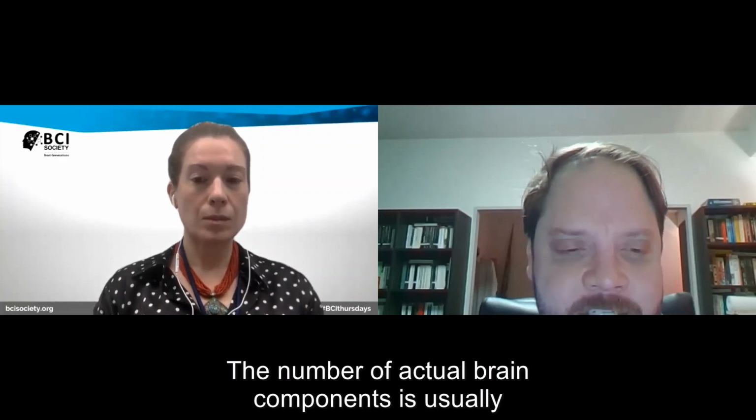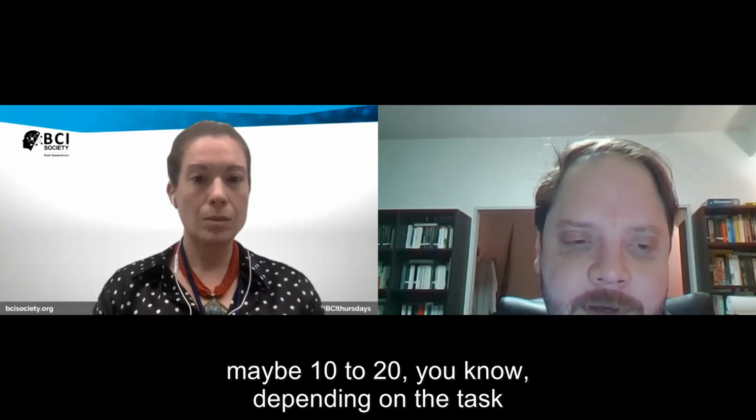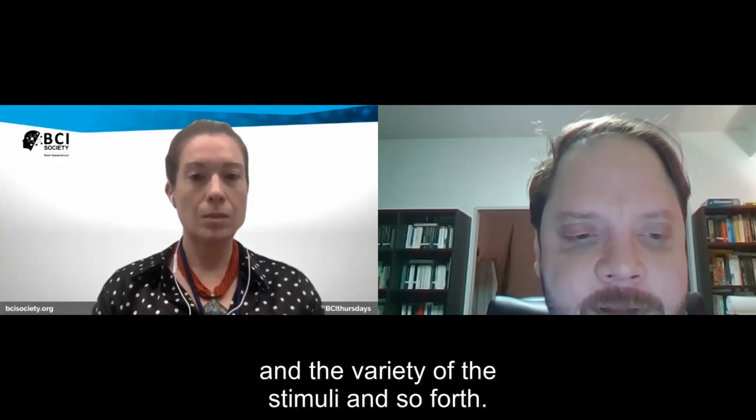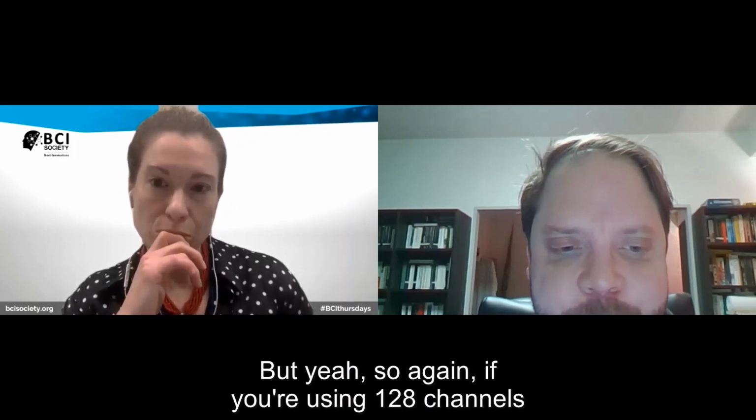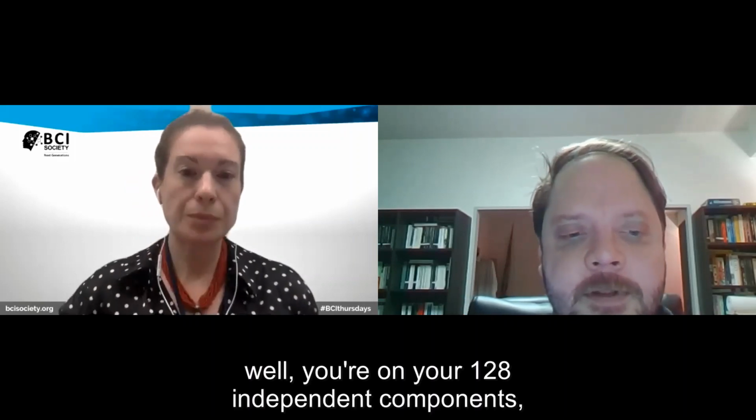And the number of actual brain components is usually maybe 10 to 20, depending on the task and the variety of the stimuli and so forth. But again, if you're using 128 channels, you'll get 128 independent components.